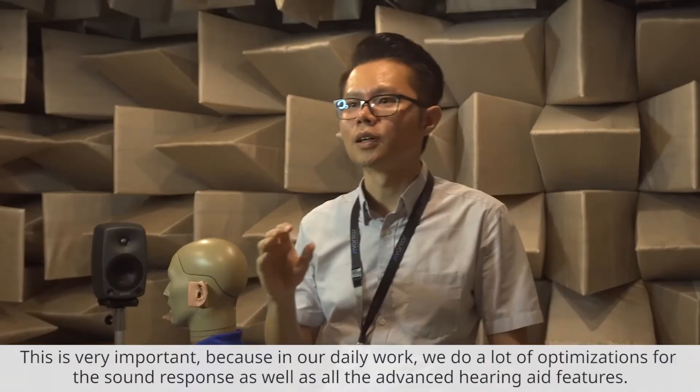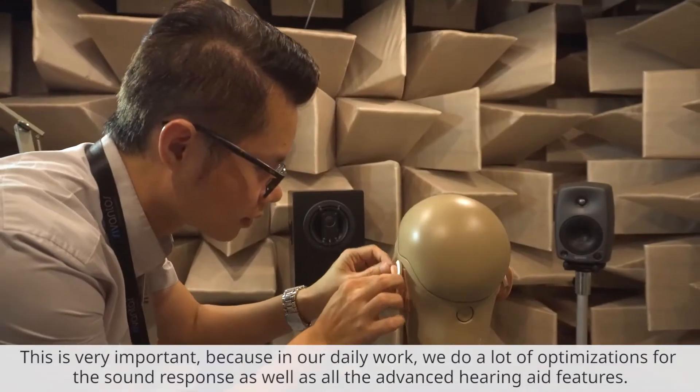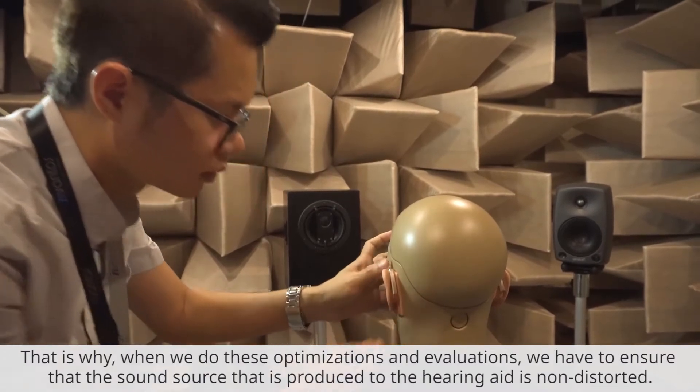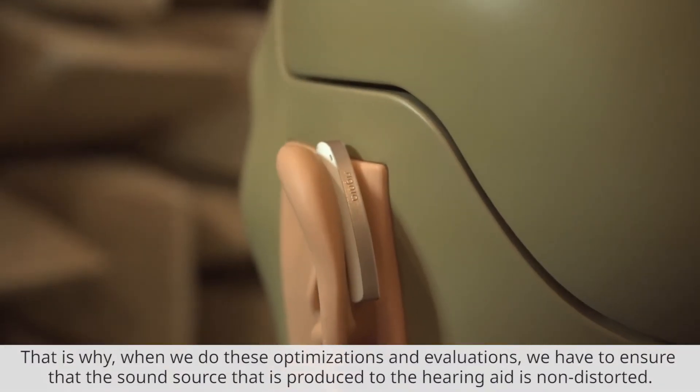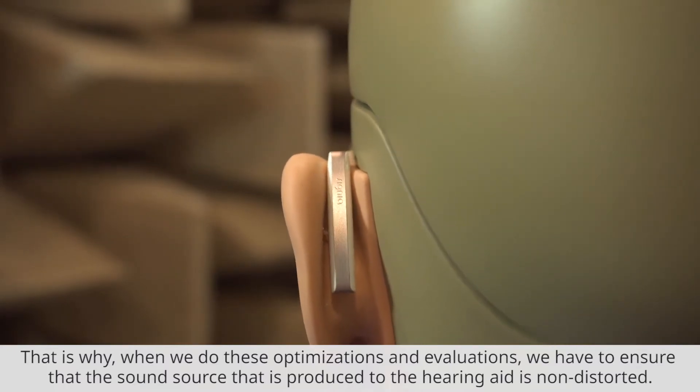This is very important because in our daily work, we do a lot of optimization for the sound response as well as all these advanced hearing aid features. That is why when we do this optimization and evaluation, we have to ensure that the sound source produced to the hearing instrument is non-distorted.